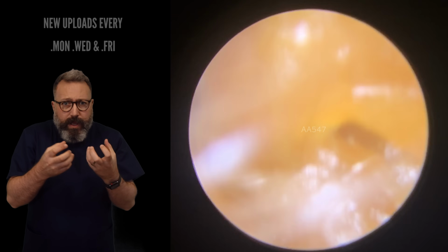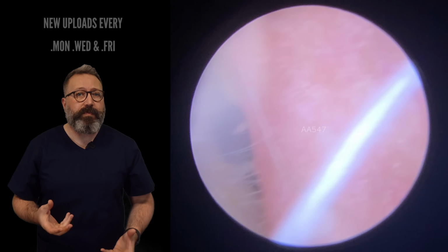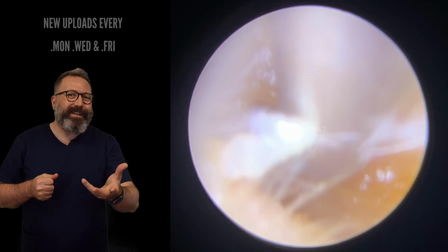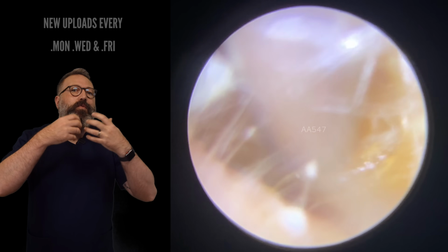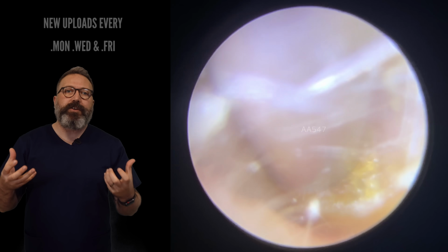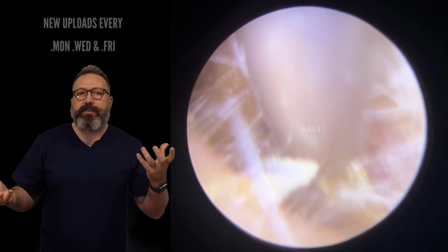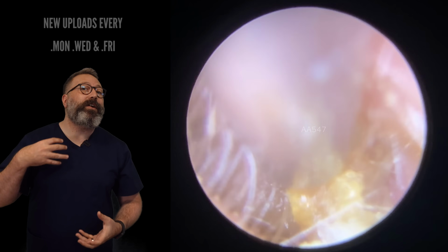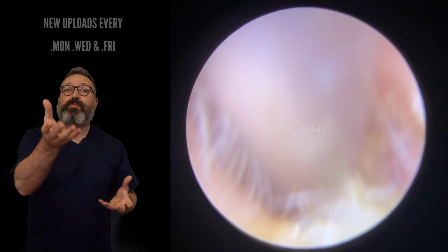Now, when patients do come through, we ask them to introduce a little bit of olive oil into their ears before they come along, just for a couple of days. Now, when you do that and you've got these kind of skin issues, which is what we've got in this ear canal as well, it softens the skin and forms this really, really good plug. So the patient feels very, very blocked up. Now, if you imagine you've got that on both sides, you're going to feel really out of sorts. So what a lot of patients will do is they'll oil one ear, and when they experience that they're feeling really blocked up, they are reluctant to do the other ear, which is what's happened here.